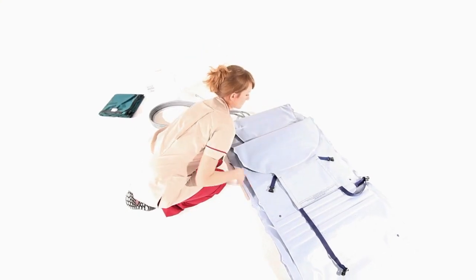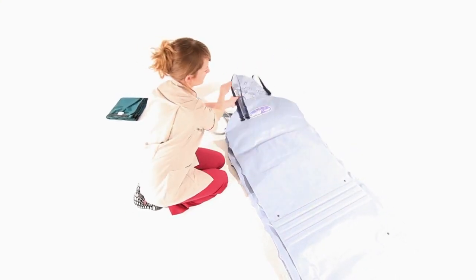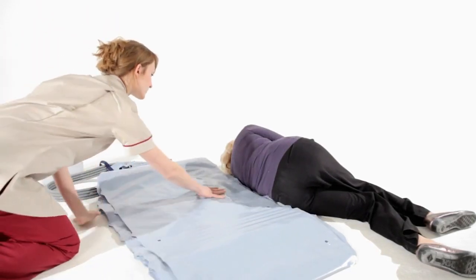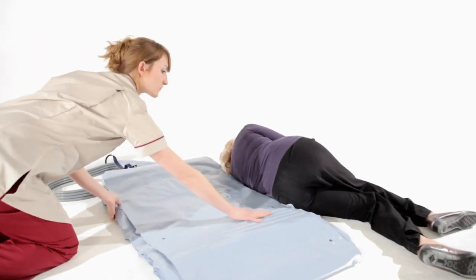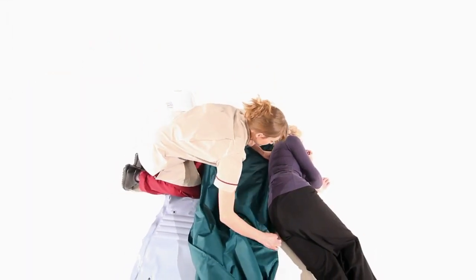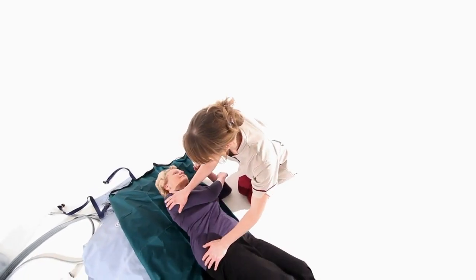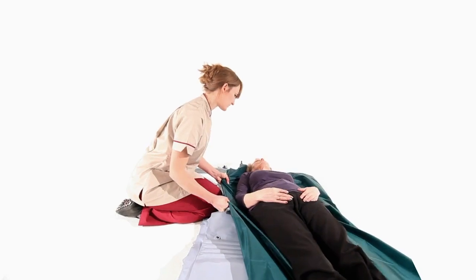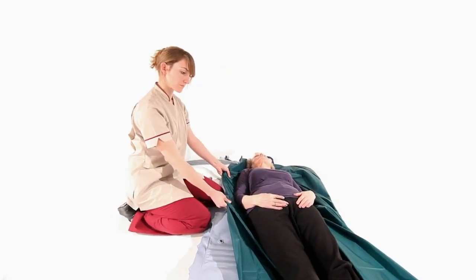Ensure that the backrest is folded outwards. From the recovery position, the carer places the Camel directly behind the person with the Camel badge in line with their head. The carer should then position a slide sheet lengthways under the person to enable them to be easily manoeuvred onto the Camel. Ideally, the person should be centred with their head on the Camel badge.